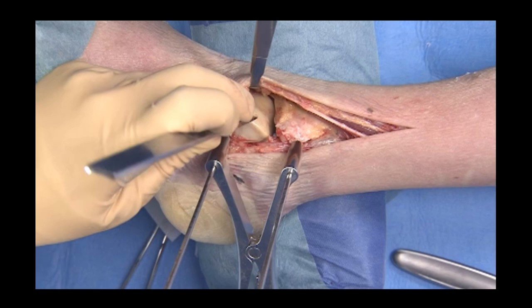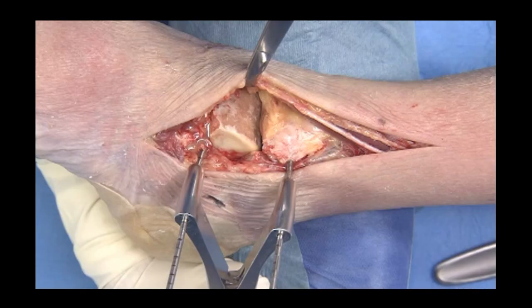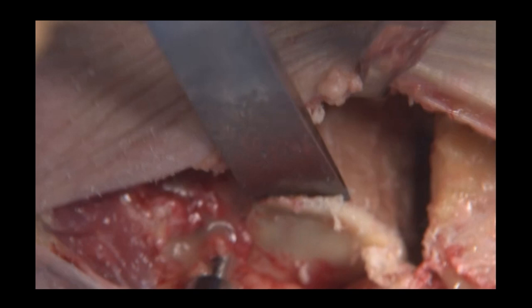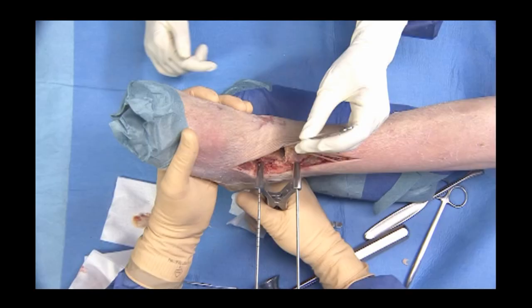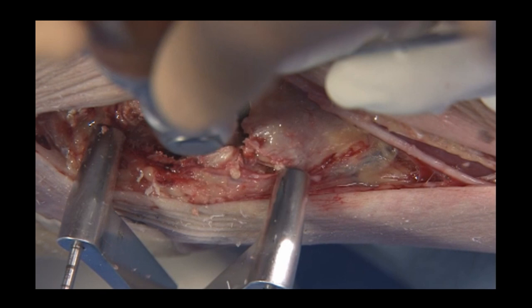Joint preparation is performed and special attention is given to preserve as much bone as possible. Cartilage is removed with a chisel and a high-speed burr. The lateral talus tubercle is resected to prevent impinging with the distal fibula. The fibular cartilage and tibial cartilage are finally resected.